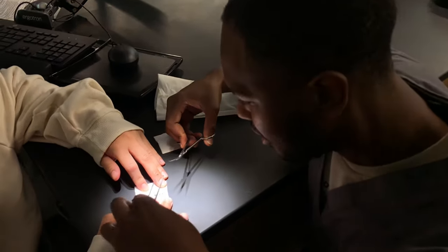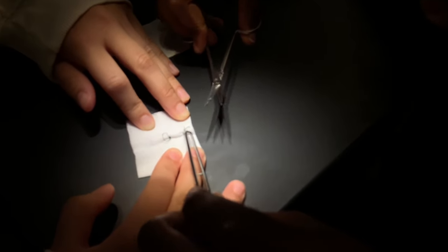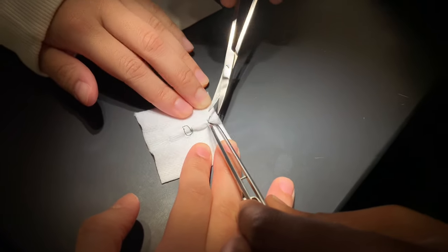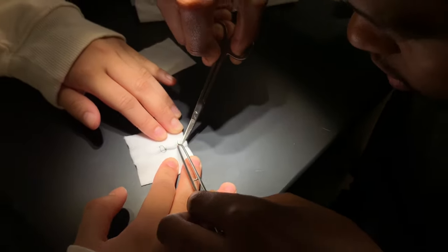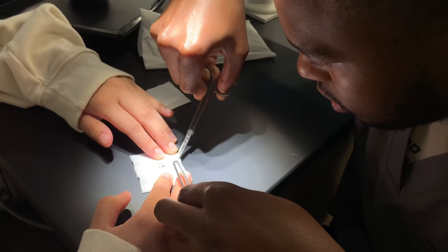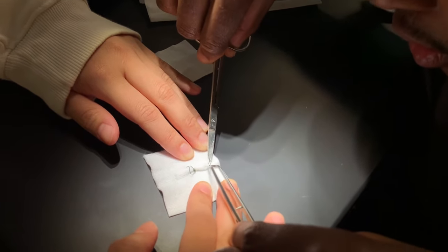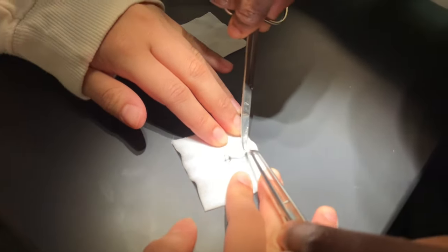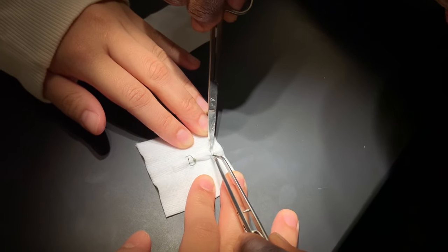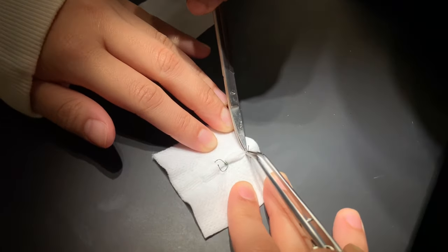They were telling me the instructions. Honestly, I think my hands are too shaky. Grab it by the nose — this one's super tight, it's really trying to pull. This one is super tight. We've done that, we've been watching our handwriting. I feel like I've never gotten it. And so then we decided... it's shaking because it's so tight. I'm stabbing the gum.